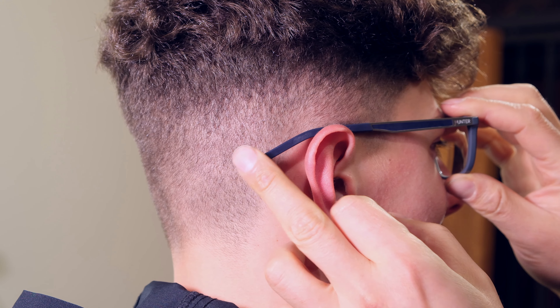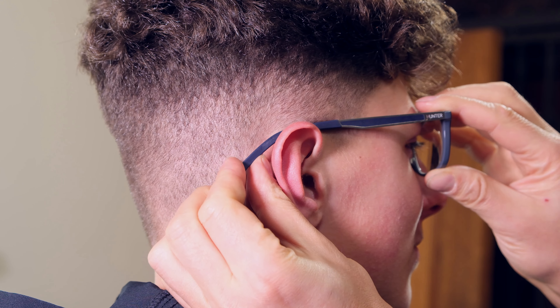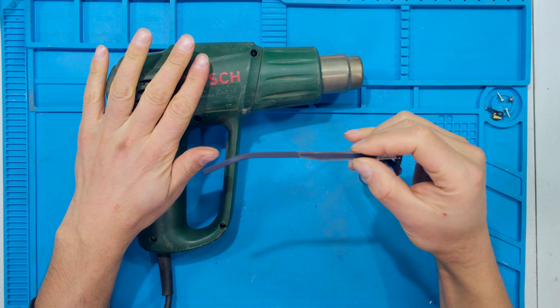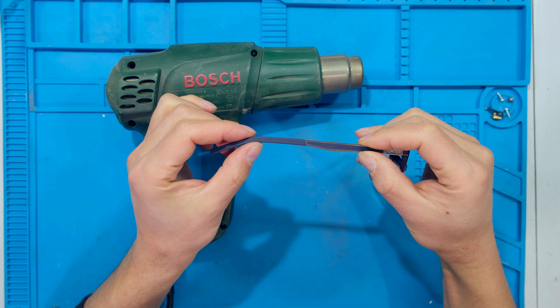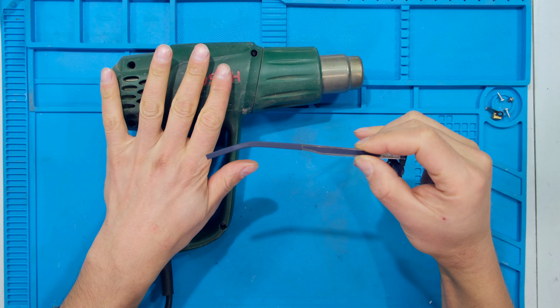You can see how the temples are loose — they should be more down and wrap around the ear a little bit more. To reform this I need to heat it up. I can use a heat gun but be very careful because with a heat gun you can easily destroy the temples, but I will show you step by step how I do it even with a heat gun.